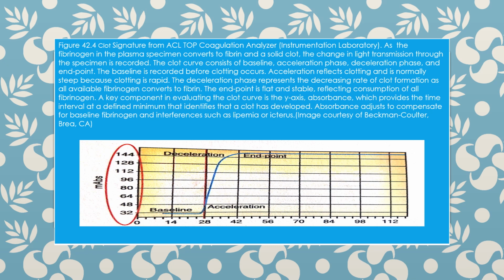The baseline is recorded before clotting occurs. Acceleration reflects clotting and is normally steep because clotting is rapid. The deceleration phase represents the decreasing rate of clot formation as all available fibrinogen converts to fibrin. The endpoint is flat and stable, reflecting consumption of all fibrinogen.